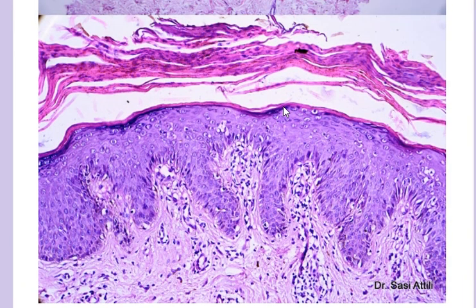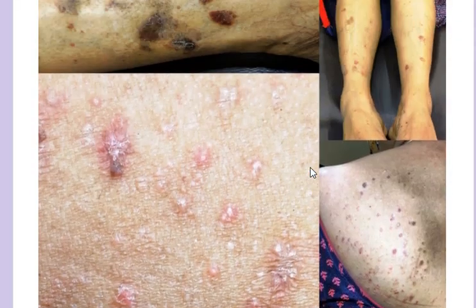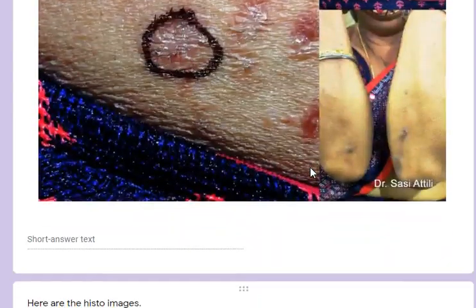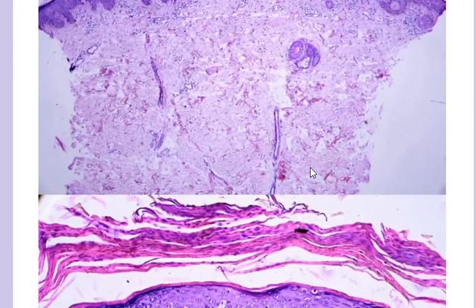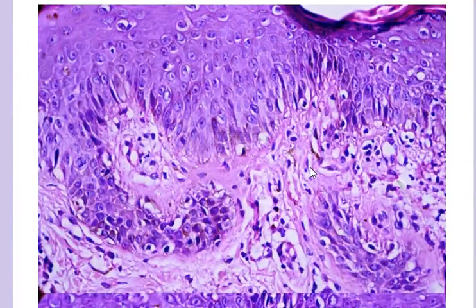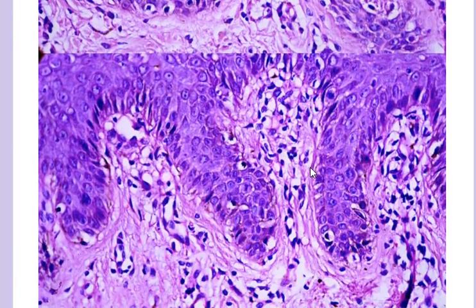Parapsoriasis is also a possibility, but one would expect a bit more spongiosis in parapsoriasis. And clinically, I don't think this quite fits parapsoriasis. But having said that, parapsoriasis is in the clinical differential. I haven't put it here because it is confusing. I think initially this patient deserves treatment as psoriasis. If the lesion evolves into something else, then we can think of parapsoriasis.